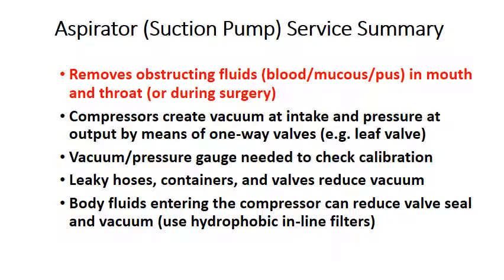Leaky hoses, containers, and valves can reduce the vacuum, and that is what is most likely to fail on these devices. But bodily fluids which enter the compressor or the regulator can reduce valve seal and can affect operation.